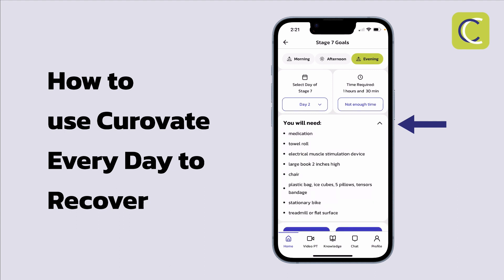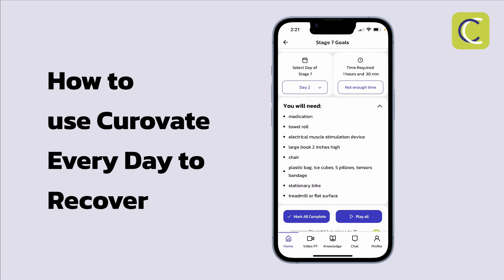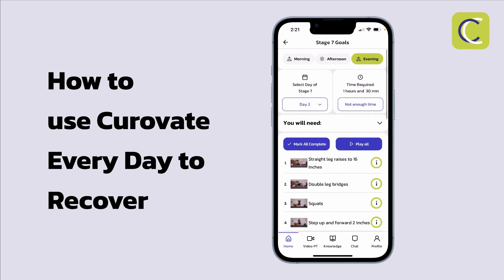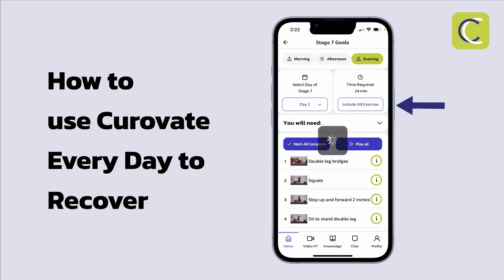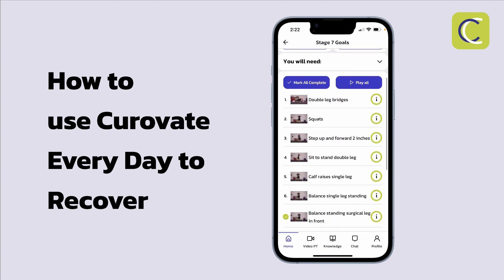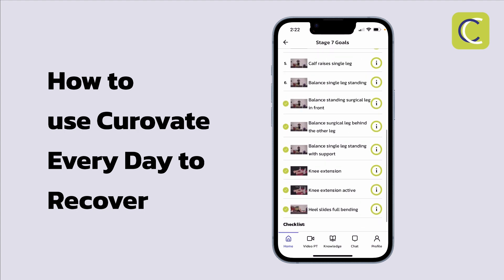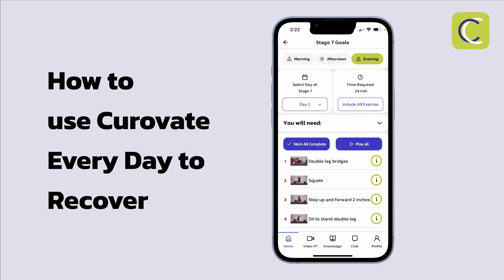Other important things to remember on these screens: you have a list of all the equipment you may need for a particular session, such as a towel roll or a chair, and sometimes things like a stationary bike. If you don't have access to a piece of equipment, you'll have to skip that exercise. You'll also see at the top the estimated time for the evening session — in this case one hour and 30 minutes. If that's more time than you have, you can select not enough time, and Curovate will prioritize the most important exercises, reducing the session from one hour 30 minutes down to 24 minutes.